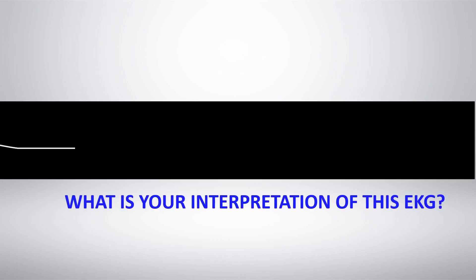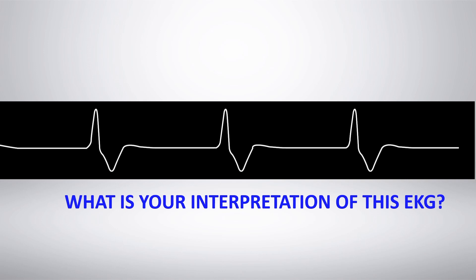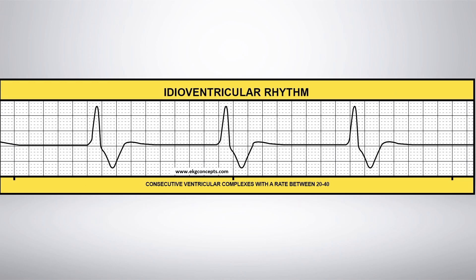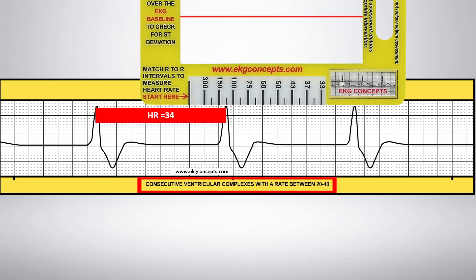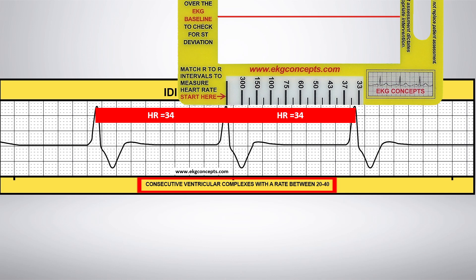What is your interpretation of this EKG rhythm strip? Idioventricular rhythm. Align the EKG badge on the R to R intervals to measure the heart rate. The heart rate is consistently 34 beats per minute.